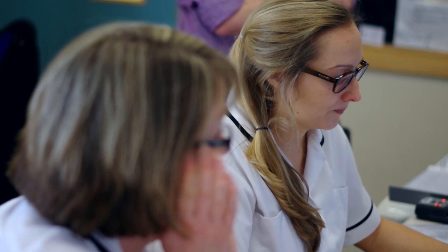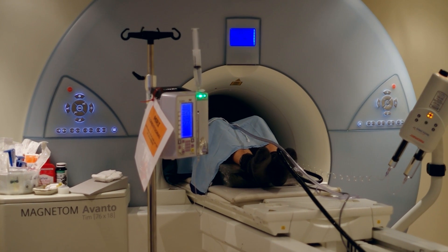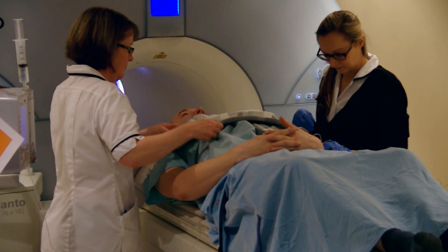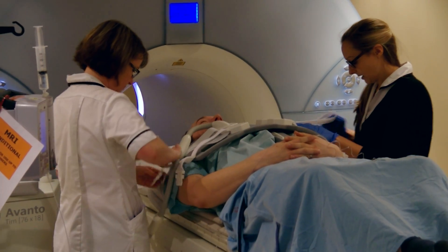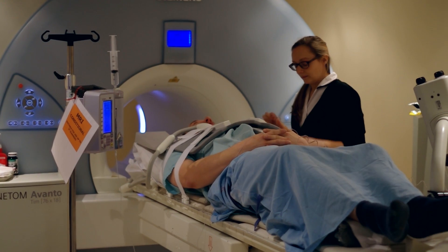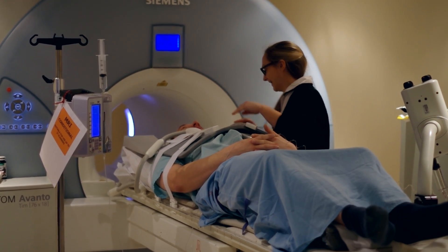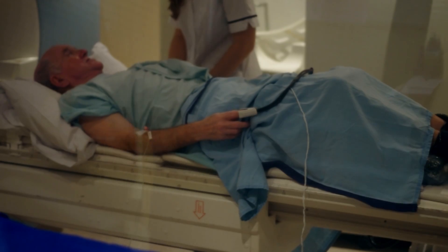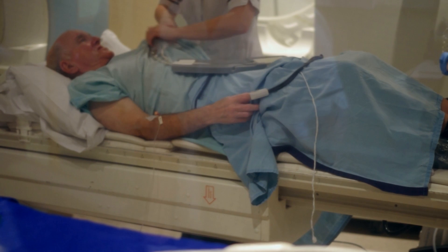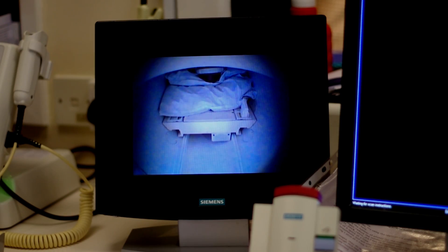Sticky dots will be put on your chest to monitor your heartbeat. You'll be given some headphones so you can hear the radiographers and to protect your hearing from the scanner, which can get quite noisy. The radiographers will put an MRI coil over your chest, which is a device to improve the pictures that we take. The cannulas will be connected to the contrast and to the adenosine. You'll also be given a call bell to hold that you can squeeze if you have any problems or concerns at any point during the scan.